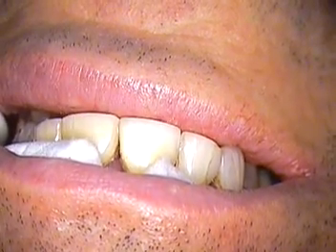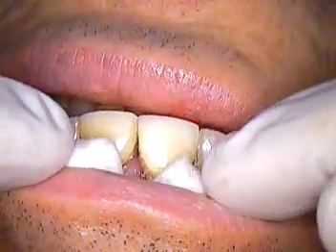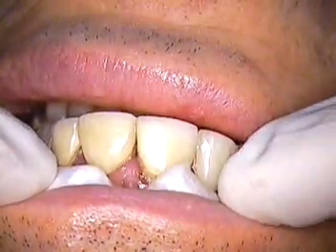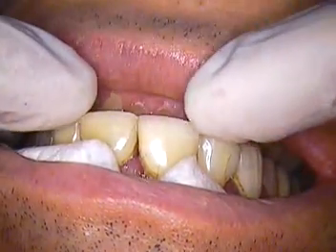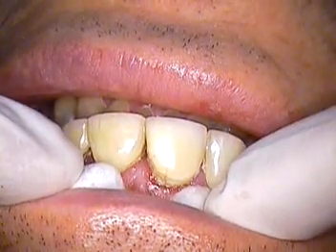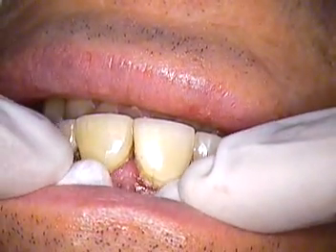Yes, this is Dr. Jerry Cuomo. I'm here with Troy's case, and we're presenting an anterior and partial posterior veneer case. We're going to be removing some pre-existing veneers that have been in place for well over 20 years, and we're at the point now of preparation design.